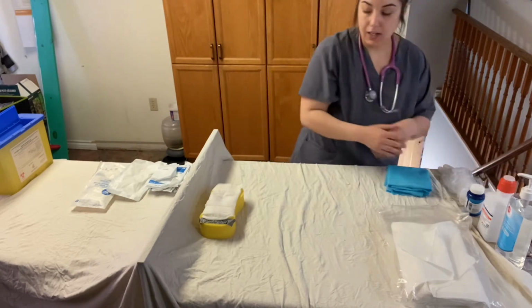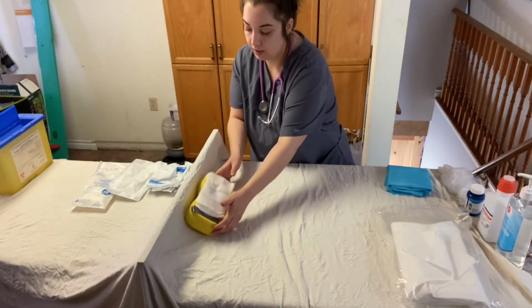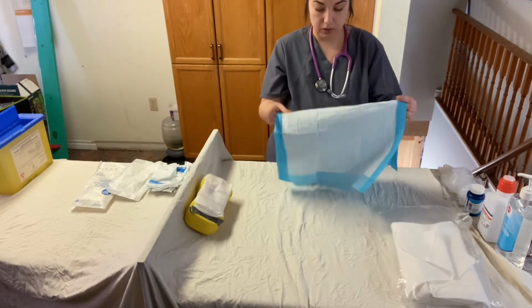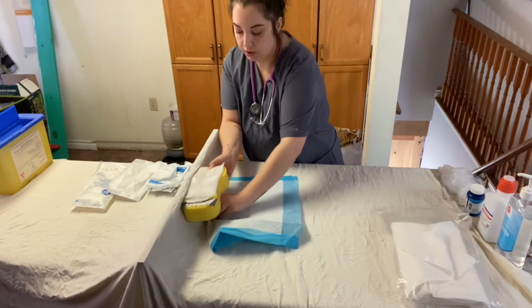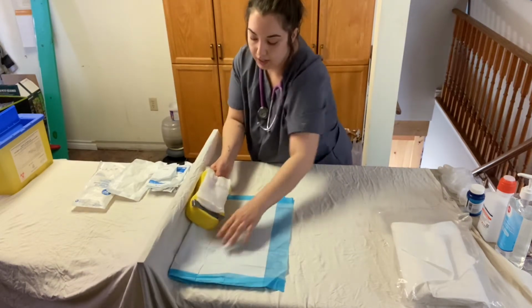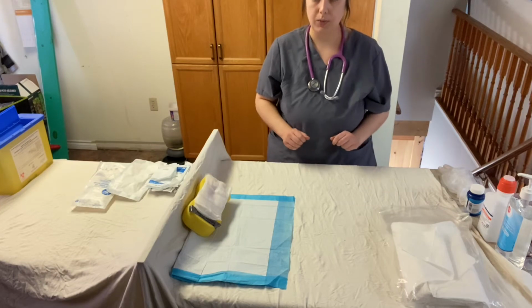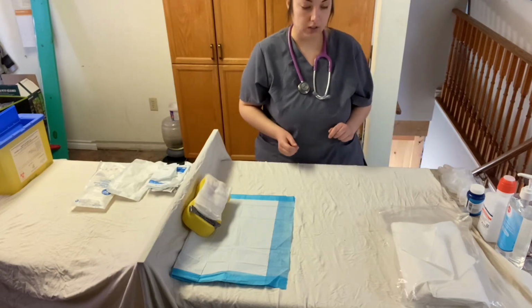Just going to perform hand hygiene here, and then Robert, I'm just going to tilt you on your side there in a comfortable position. Perfect. Are you comfortable? Fantastic. And then I'm just going to put this blue pad underneath you. If you could lift your leg. Thank you. And this blue pad will allow for any drainage, irrigation, or fluid to fall onto the blue pad as opposed to in our sterile environment or onto the patient's bed.